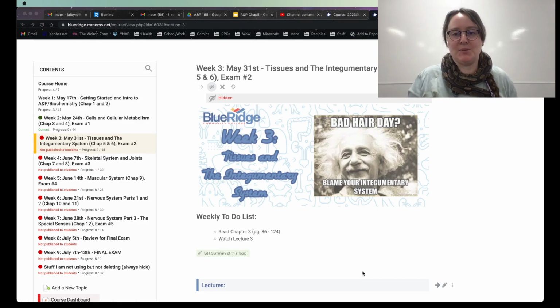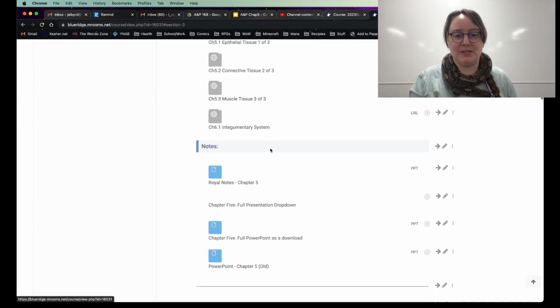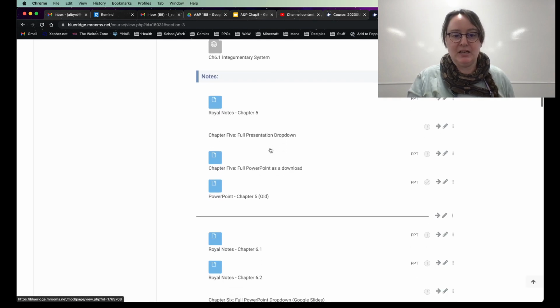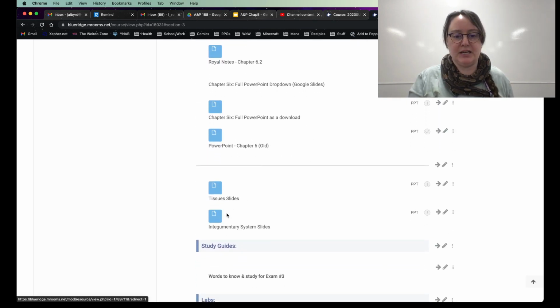So I'm not so much going over what's in the book. I'm actually just going to show you real briefly some slides that I've put in here. You'll notice it says hidden, FYI. That's because I'm recording this before you even get to this yet, so there's some things up in here that aren't up yet. Anyway, you'll roll down here and you'll notice I have tissue slides and integumentary system slides.